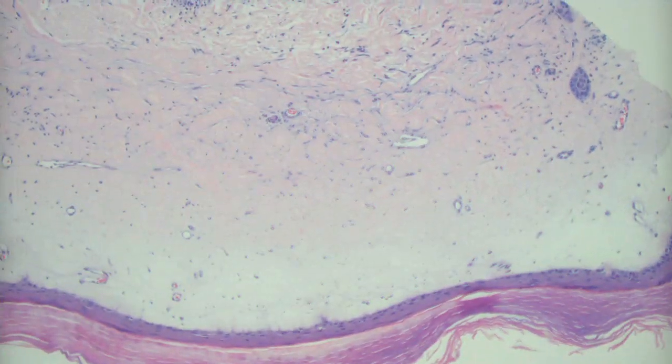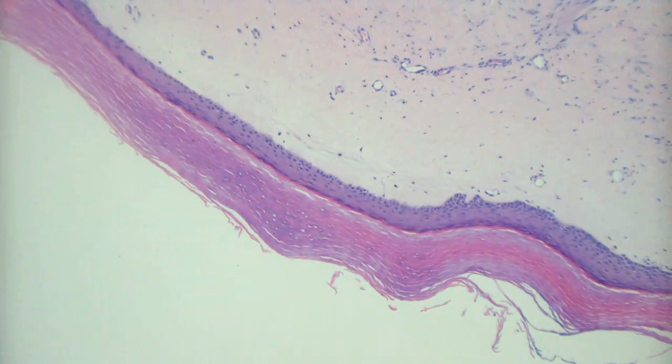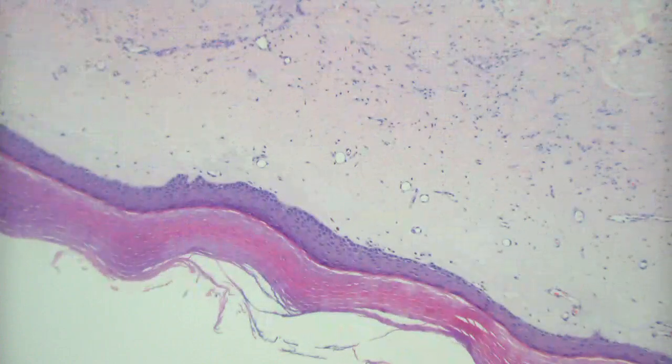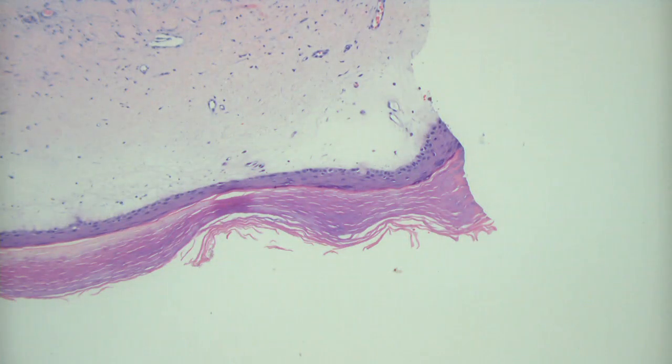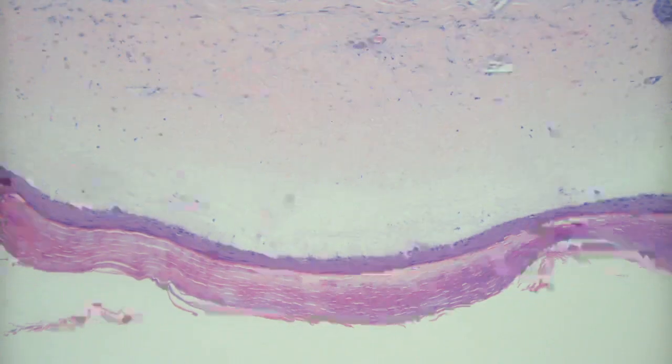What do you see in an early stage? You see a really dense infiltrate. Yeah, it can simulate lichen planus. And sometimes when it's pretty early, they don't have much sclerosis, and it's tough to completely exclude it from lichen planus or lichenoid vulvitis if it's in the groin area, something like that. So basically, when it gets to this stage, most of that infiltrate's gone away.